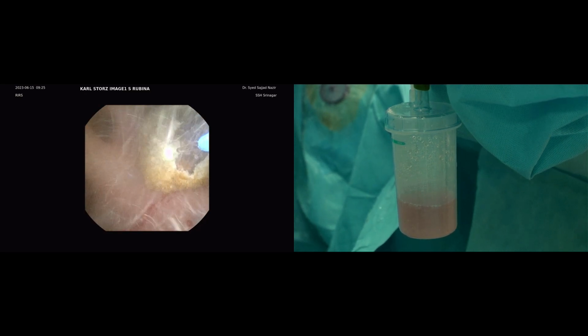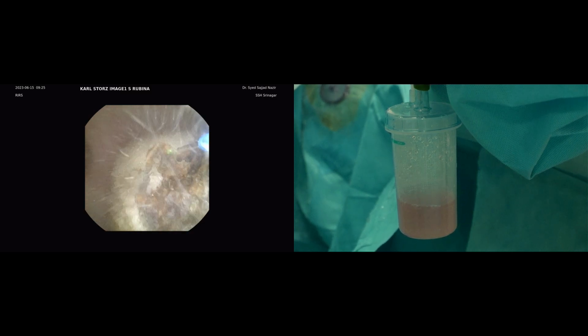Can you enlarge the operative picture? They are just showing the suction beaker. We don't want to see that.